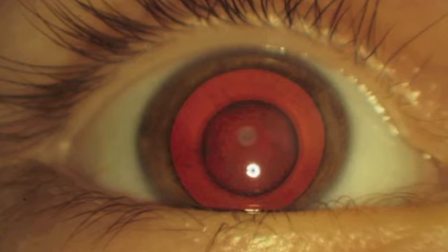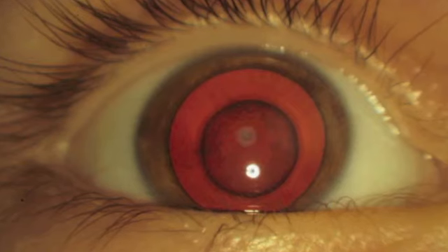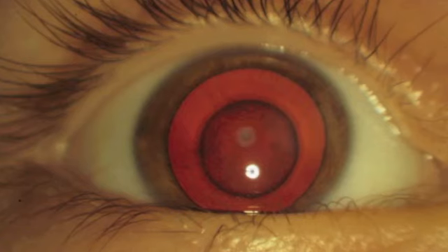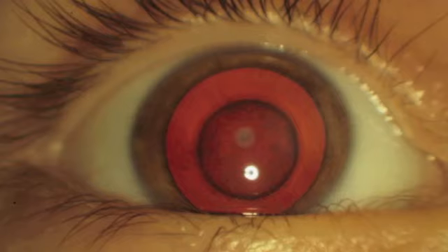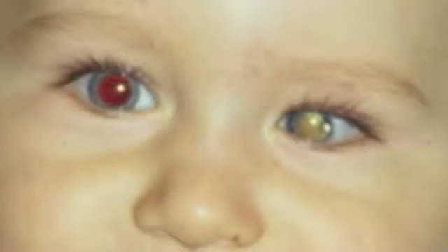However, if a child has a complete black reflex in each eye, this may simply be due to small pupils, especially in infants. Instill dilating drops to make the pupils larger, check again in 20 minutes. If the red reflex is then normal, then no referral is needed.